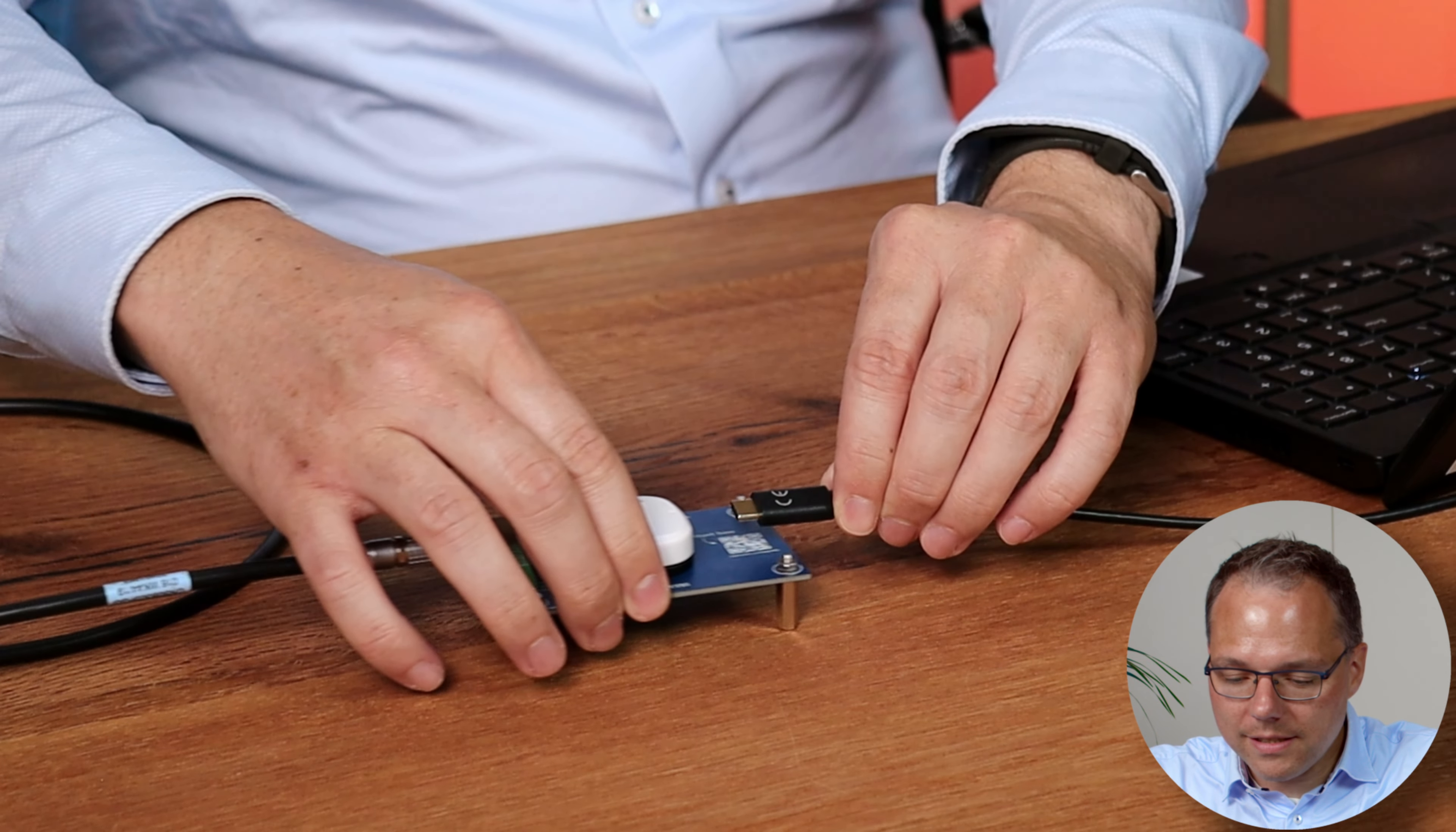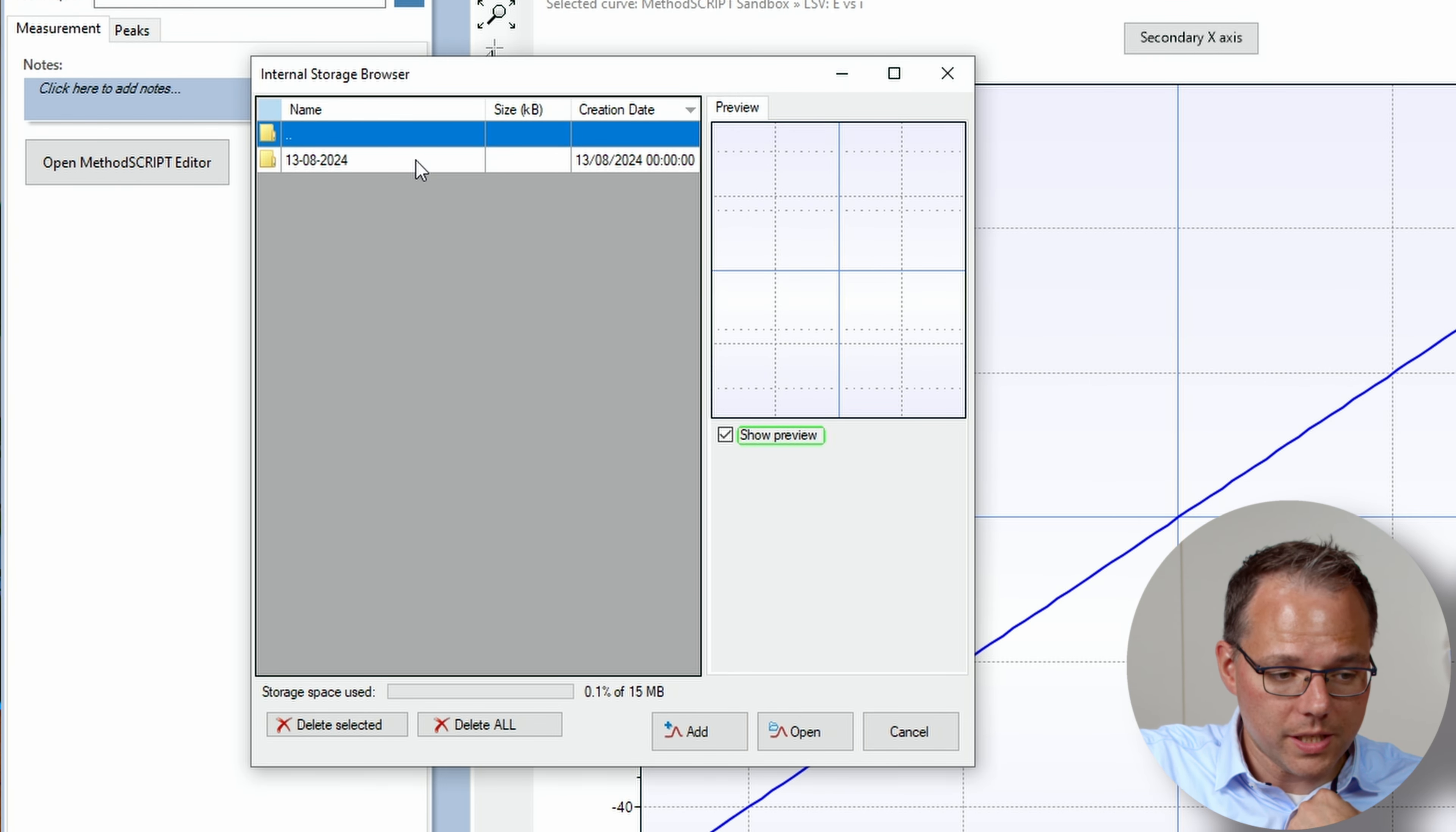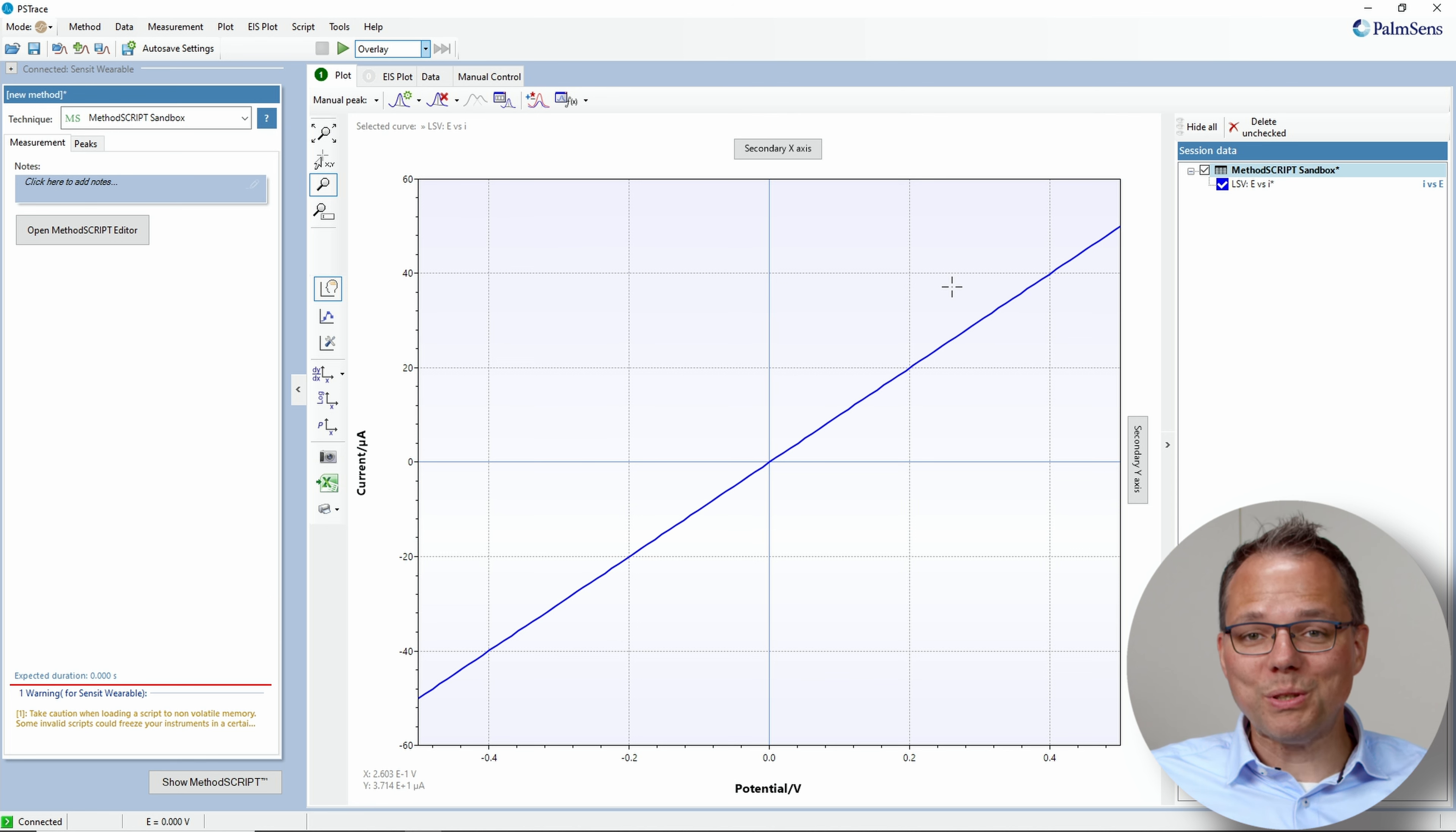If I connect now again in PS trace to the Sensit wearable I can load the data from the internal storage that was just recorded just by switching it on. And here we have it. I just open it and it's the same LSV that was previously recorded.